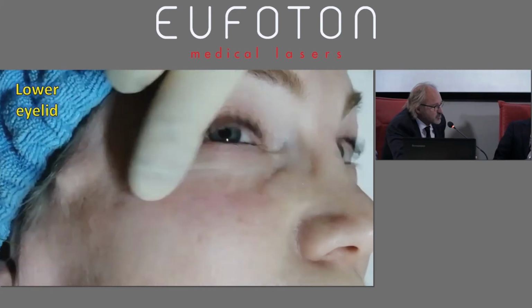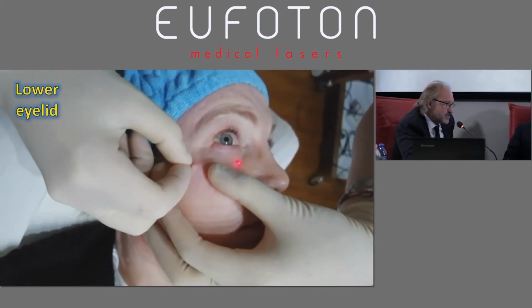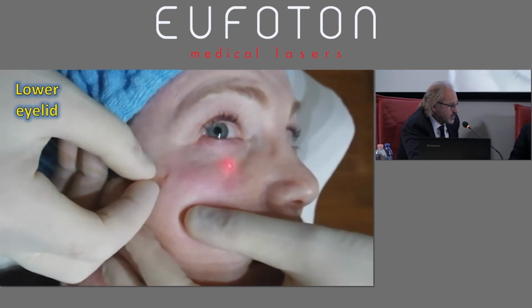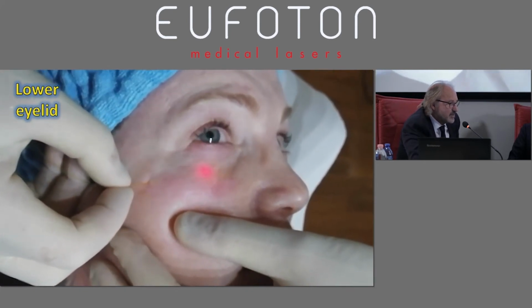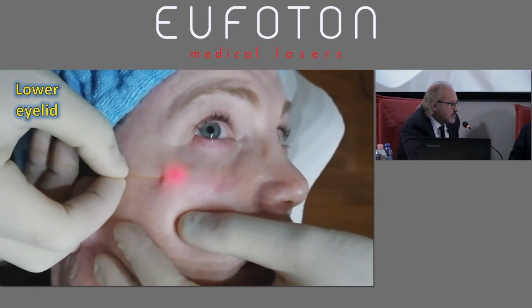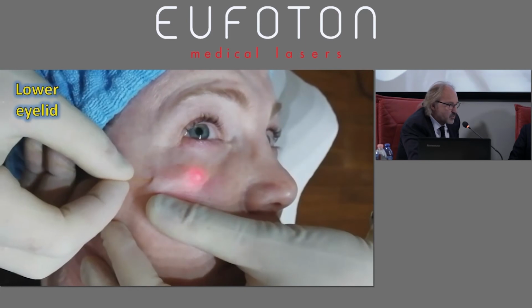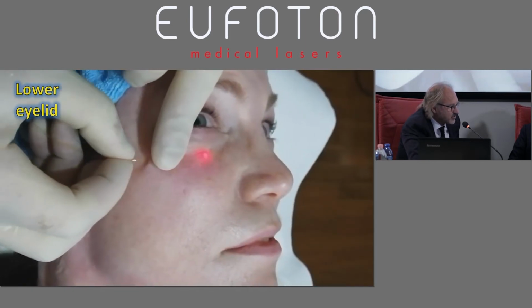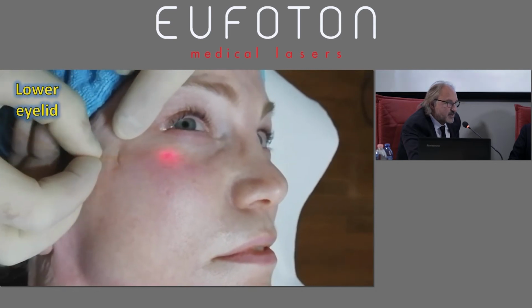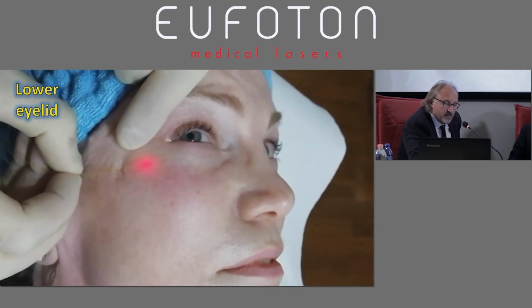I do not do any anesthesia in fearful patients because of the area. Sometimes I do some infiltration, sometimes with the filler cannula, 2.5 syringe, dilution 1 to 3. I just try to keep it a very dry anesthesia, to be on the safe side.